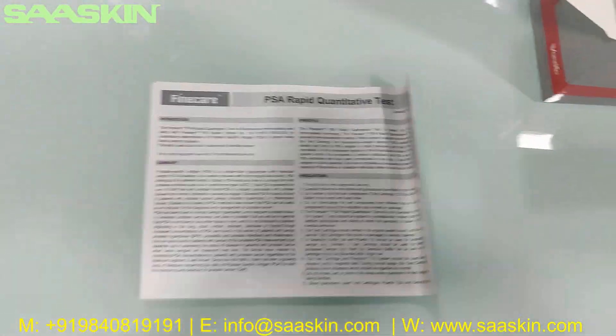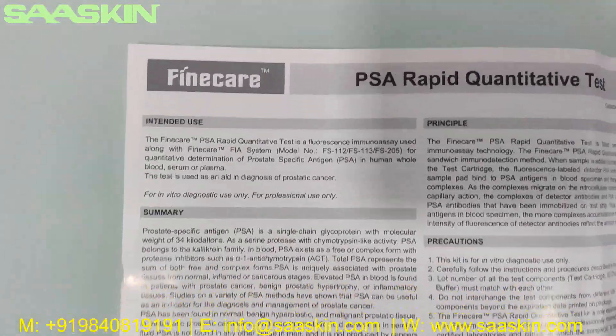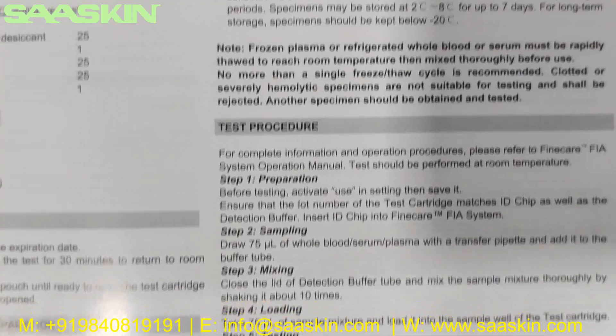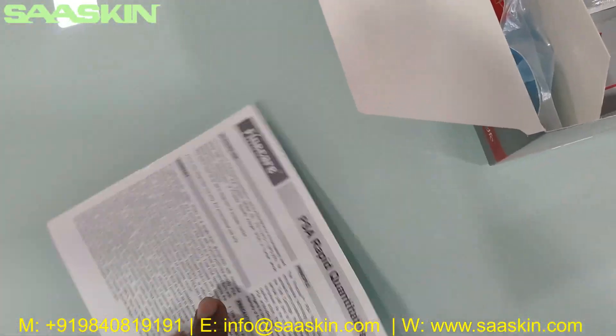This test is used as an aid in the diagnosis of prostate cancer. So this is the IFU brochure — instructions for use. You have the complete details here, like the key summary and precautions, how to prepare your samples, how to conduct the test procedure, and how to interpret your results.